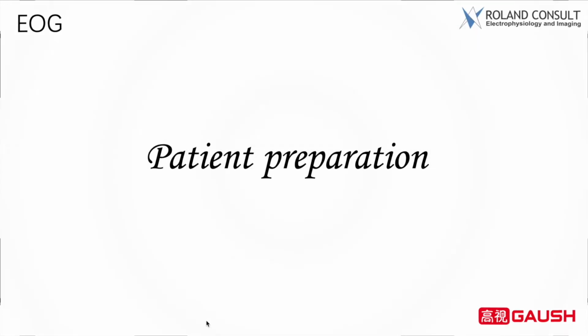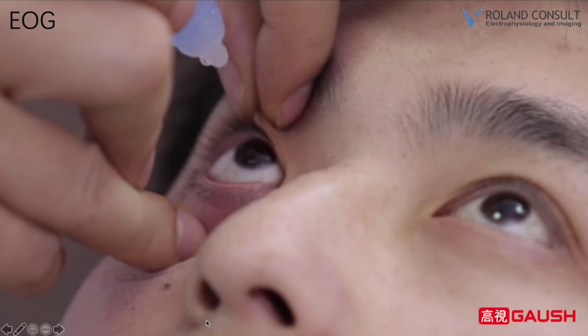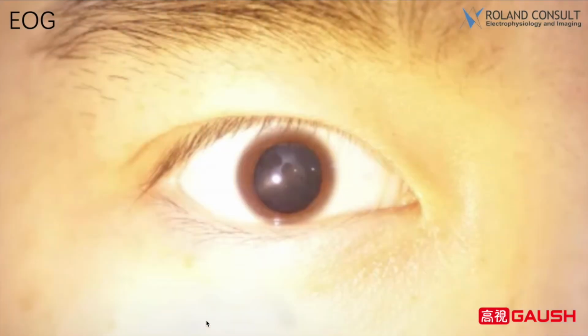Patient preparation. At least 30 minutes of natural light adaptation should be done before the examination. Fundus fluorescein angiography and fundus photography should not be performed before the examination. Before EOG examination, both eyes' pupils should be synchronously dilated to a maximum size, at least 8 mm. Record pupil size before and after examination.